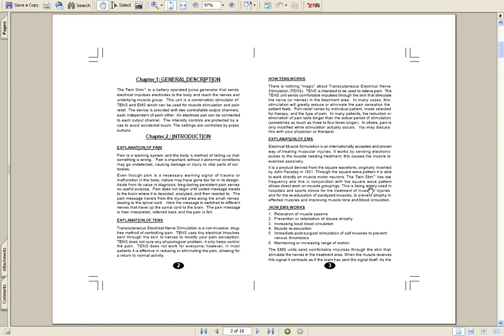I've personally fit some Arizona Diamondback starting major league players that had microfracture knee surgery with muscle stimulation devices. And the reason why is with microfracture knee surgery, they're attaching all these little microfracture attachments, and they're not even weight-bearing for a month. Like, for an entire month, they can't put any weight on their leg.